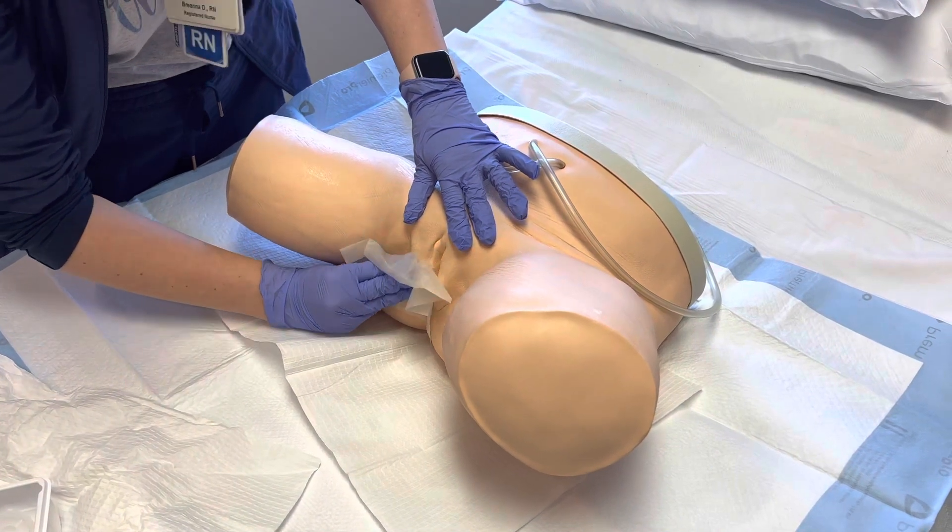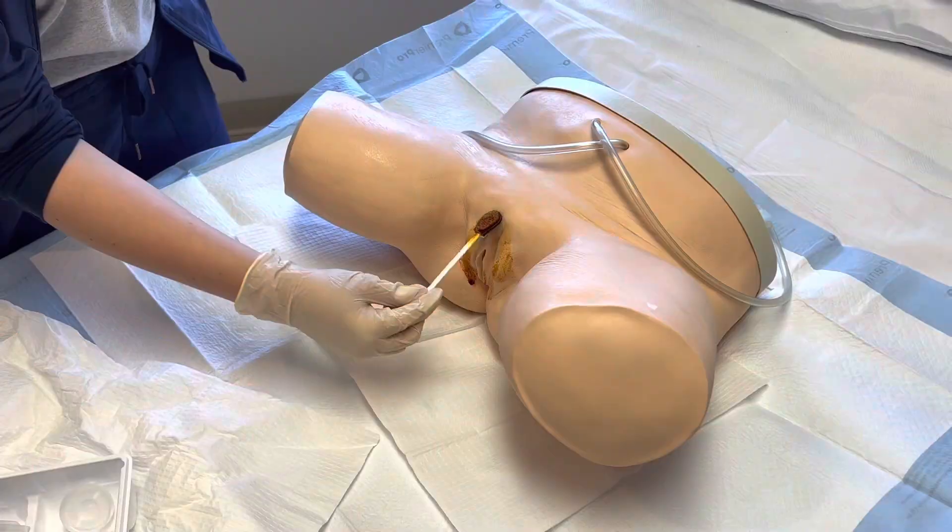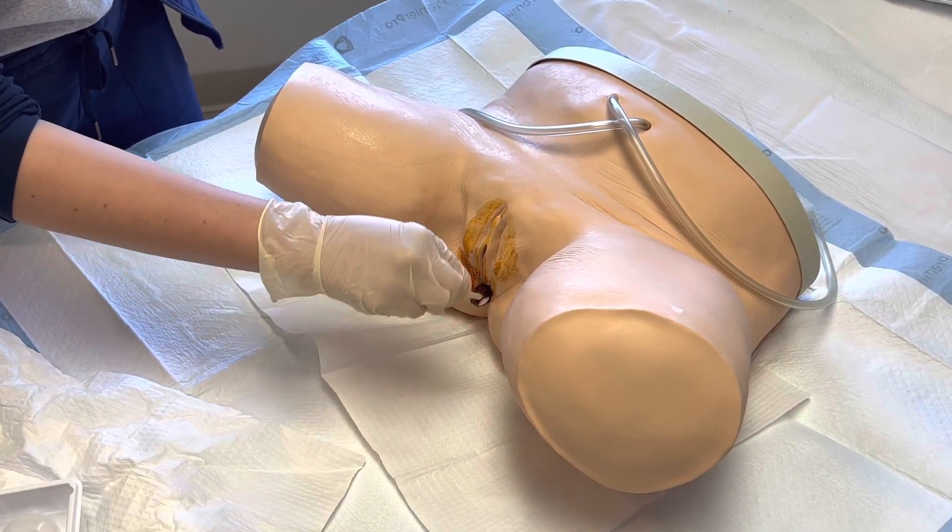Complete high-quality pre-insertion peri care. If a patient is soiled, they first need to be cleaned up. Then staff should use Castile wipes and Betadine.